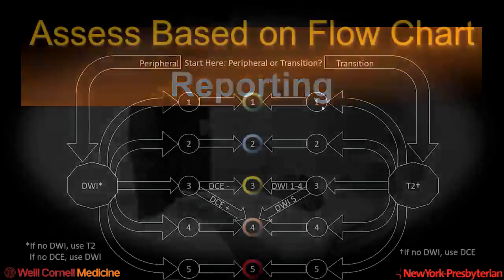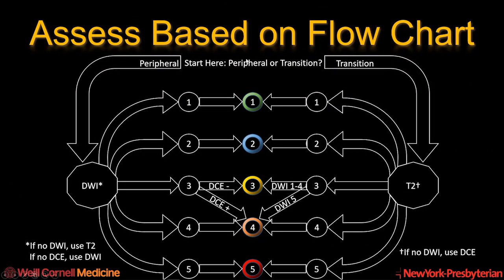This brings us to reporting. The assessment is based on a flowchart. You consider first whether it's peripheral or transition zone, then look at the dominant pulse sequence — T2 in the transition zone, DWI in the peripheral zone. For categories 1, 2, 4, and 5, the overall category is the same as the pulse sequence category. For category 3, you need to look at one other pulse sequence: dynamic contrast in the peripheral zone, and diffusion-weighted imaging in the transition zone. In PIRADS 2.1, there will also be the ability to upgrade a T2 category 2 lesion to overall category 3 depending on diffusion-weighted imaging.